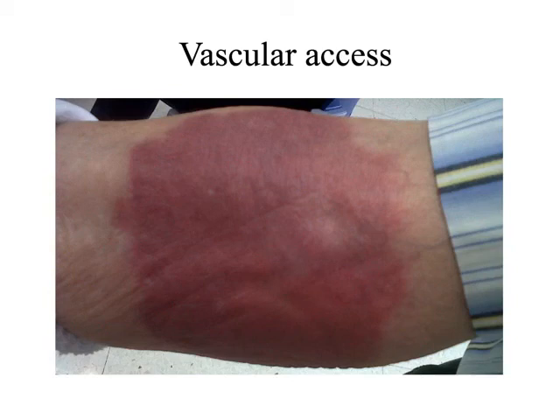This is about 2 or 3 weeks out on an extravasation. So, in addition to these kind of gnarly skin effects, we can also have what's called compartment syndrome. A lot of times we choose vessels that are close to the elbow, right, or close to the wrist. If an extravasation occurs and it somehow infiltrates or compromises the synovial cavity around the joint, it could cause irreparable damage to that joint, right? Like pain and all sorts of stuff.